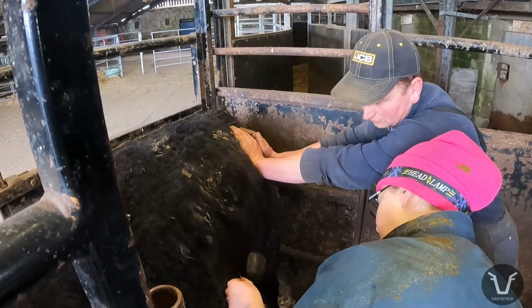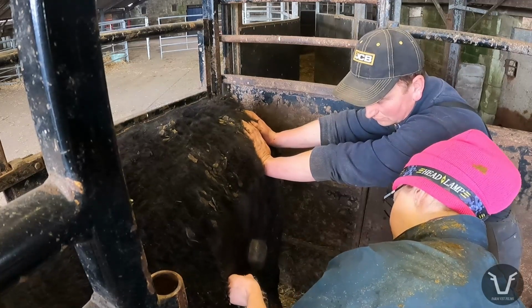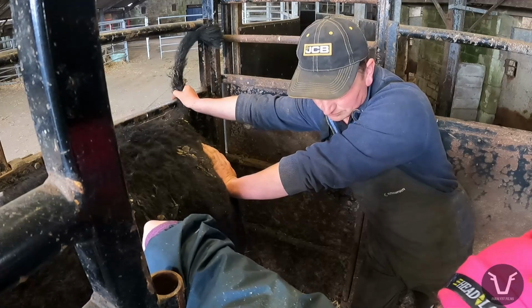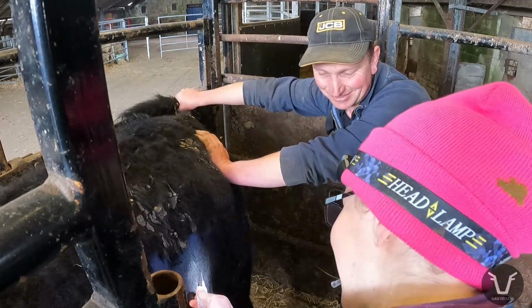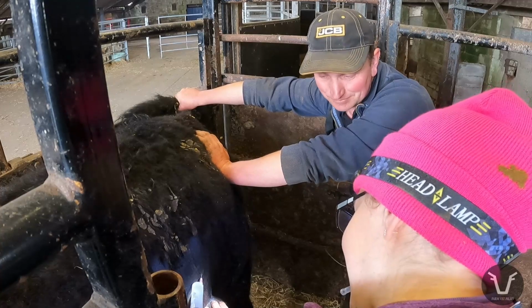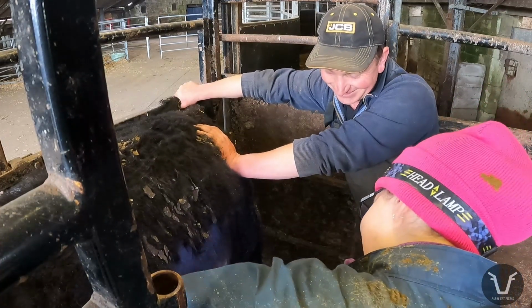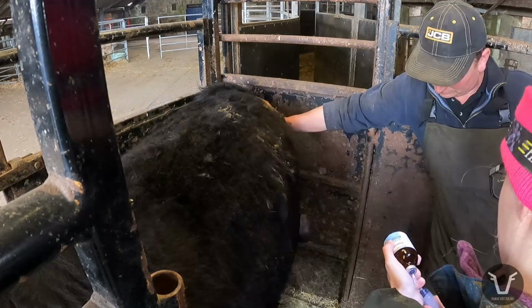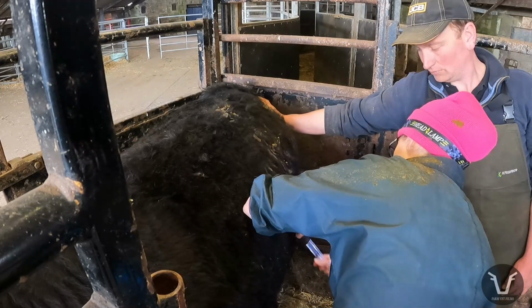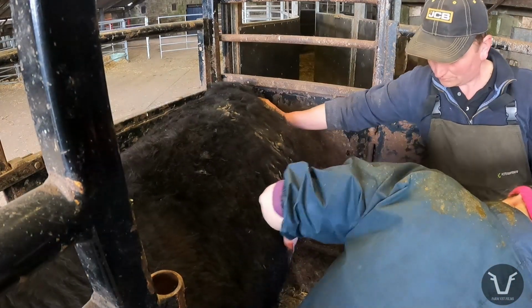First things first, this bullock needs anaesthetising. Like most of the surgeries we do, Claire is using local anaesthetic, meaning he's conscious, but the area being cut is numb. To make him a bit more relaxed, he's also had a smidge of sedation. Not so much that he goes to sleep, but just enough to take the edge off. After that, the clipped area is prepped by washing it with some hibiscrub and then with some surgical spirit. Once this is done, he will be good to go.